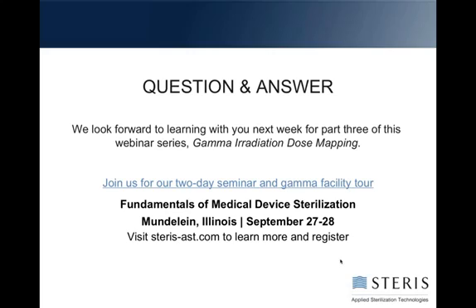The next question here in our panel is, can you speak to the use of adverse substance screening in lieu of BF testing? I don't believe it's in lieu of. Adverse substance screening is more related to bioburden, to assure that you're getting accurate numbers with the bioburden test. BNF is directly related to the sterility test conditions.